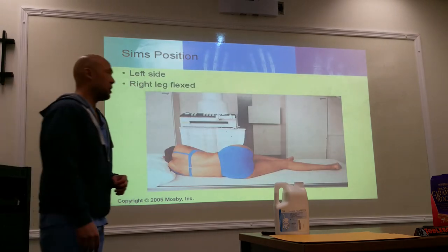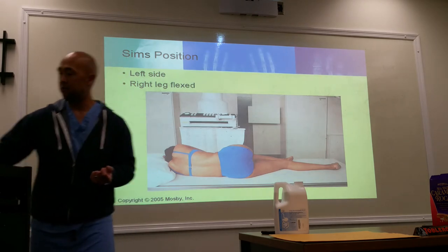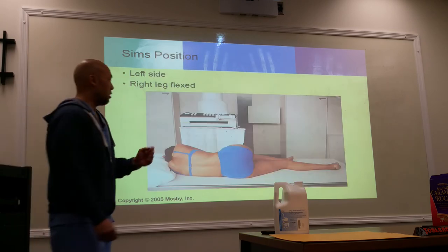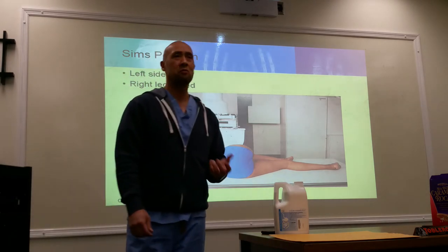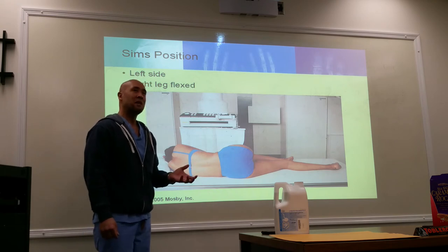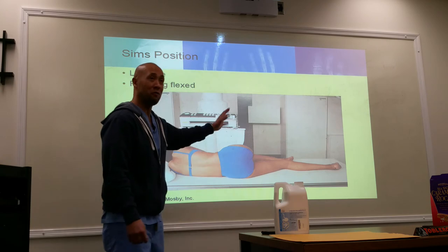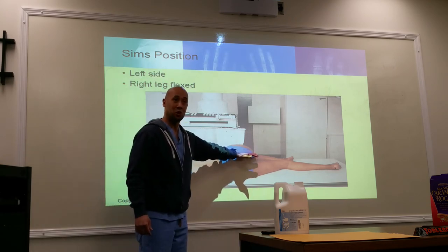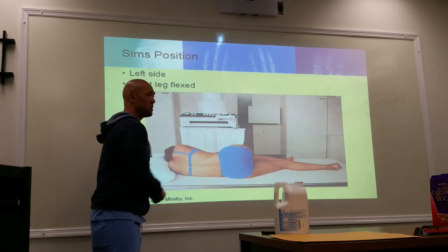This is the position that you're going to place your patient in when inserting the enema tip. Make sure you roll the patient on their side. Please practice good modesty. Make sure they're properly covered. You will have patients saying, honey, there isn't anything that nobody's seen, and they'll allow you to do whatever you want with them. But you still want to keep them covered as best as you can. Roll them up on their side.